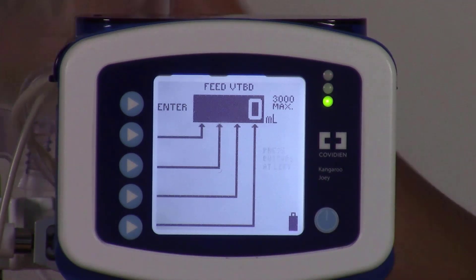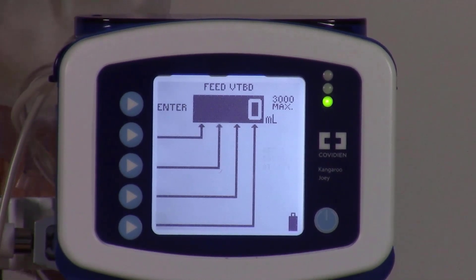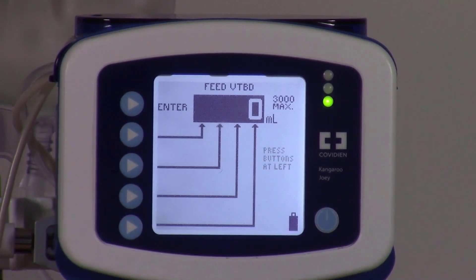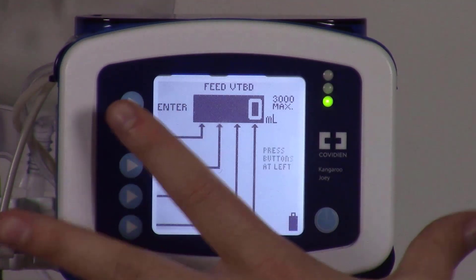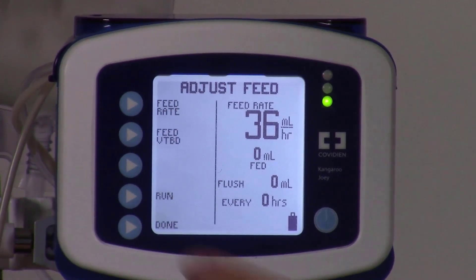We prefer to wait until the formula in the bag runs out, which will give us an alarm to refill the feeding bag. So ensure that the feed VTBD remains at 0. Select enter, then press done.